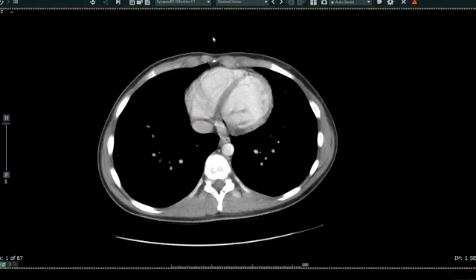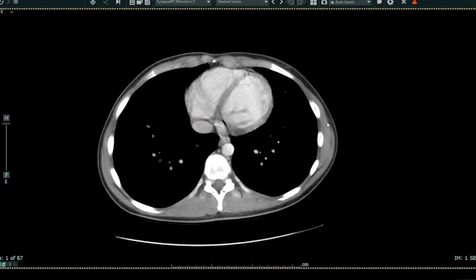To orient you: this is the front of the patient or anterior, this is the back of the patient or posterior, this is the patient's left side, this is the patient's right side. These dark structures here are the lungs, here's the heart, here's the spine, and these white structures out here are ribs.